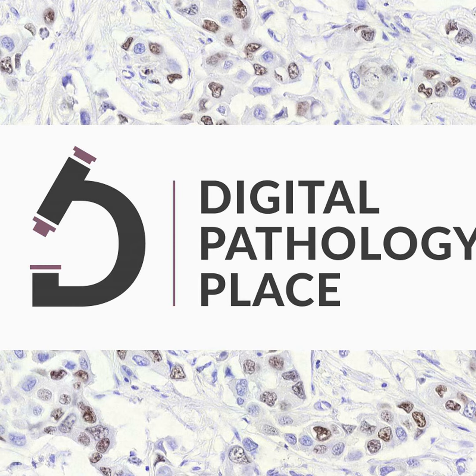Unlike static digital images that we are used to taking with our smartphones and other digital cameras, whole slide images are very big in terms of data. One whole slide image of a full tissue slide at 40x magnification can be as big as a 2-hour high-definition movie. That's around 4 gigabytes of data.